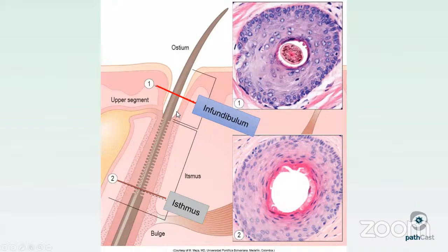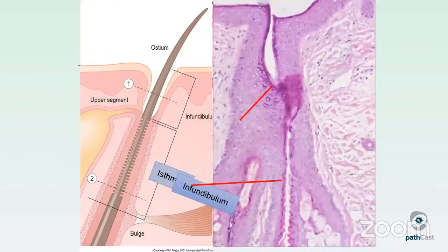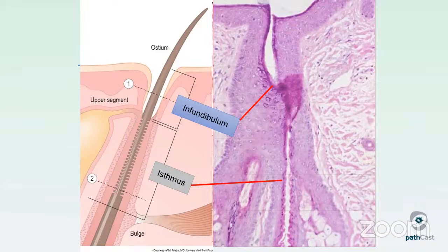Marching our way up to the infundibulum. So now we're at the tippy top of the follicle, almost there, guys. And so here at the infundibulum, we now have normal, basically epidermal pattern maturation. So here our keratinocytes are going to mature with a granular layer.